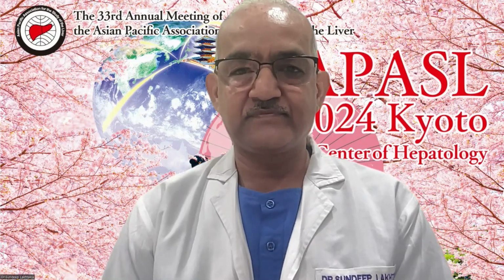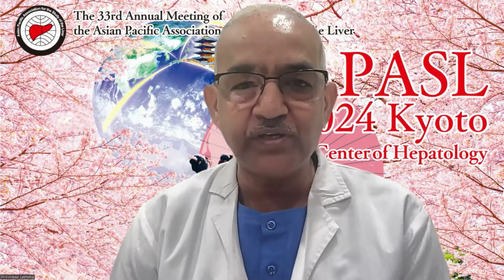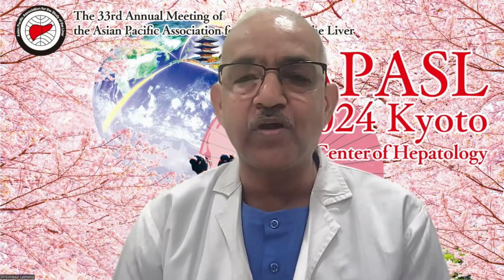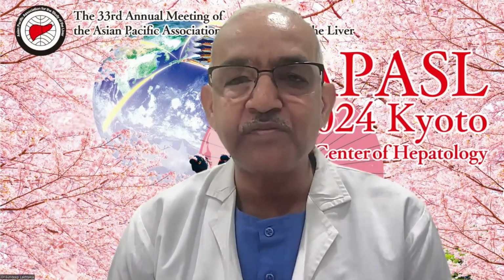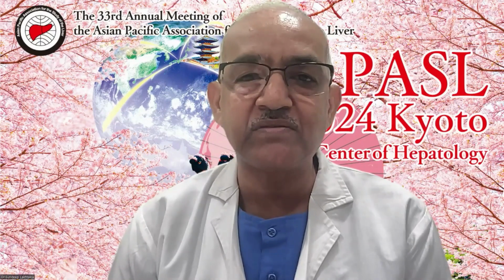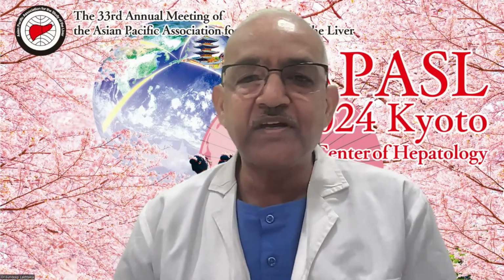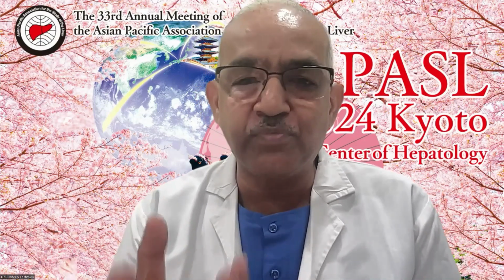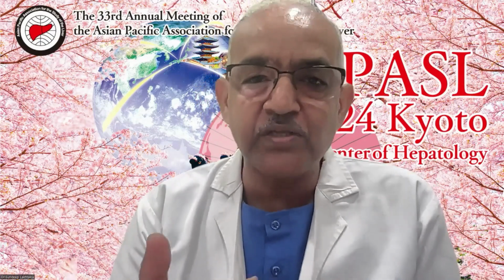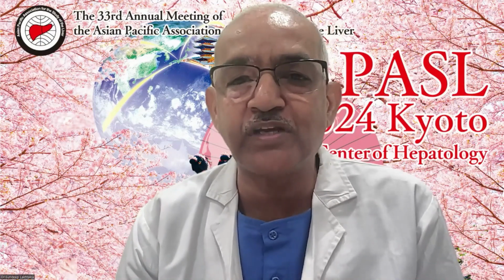What do you think? Thank you, Pradam, for your comment and question. Yes, BRTO has been an excellent technique of blocking these varices. But for that, we need to have a shunt between the renal vein and this bunch of collaterals which are there in the fundus. There are several exit points from this bunch, so what they do, for the people who do not know, is block them under fluoroscopic angiographic embolization by the IR team.